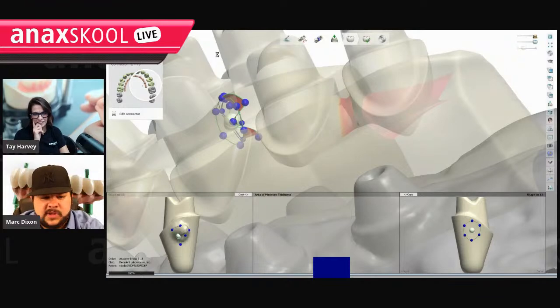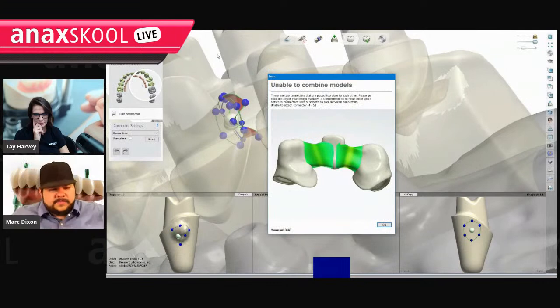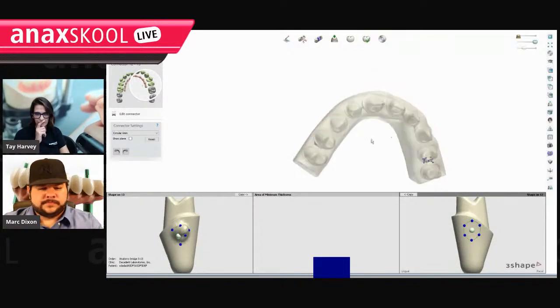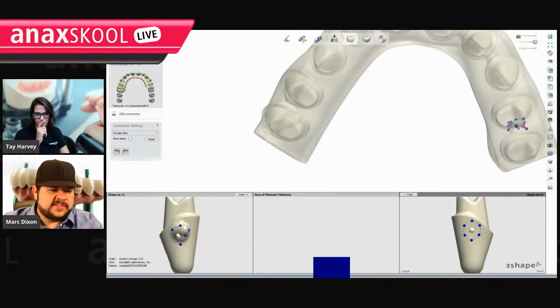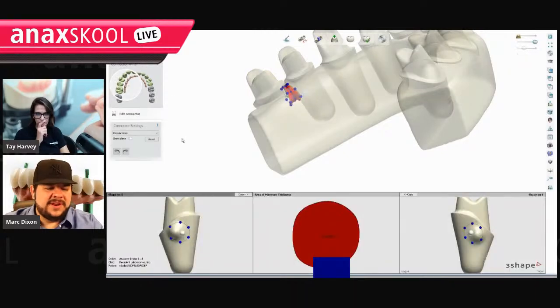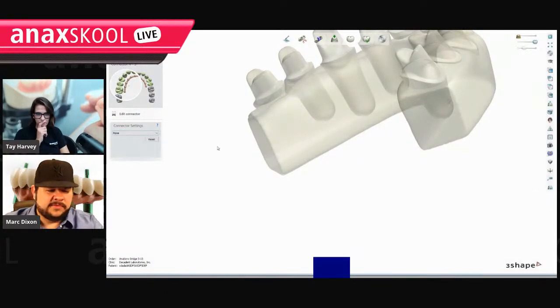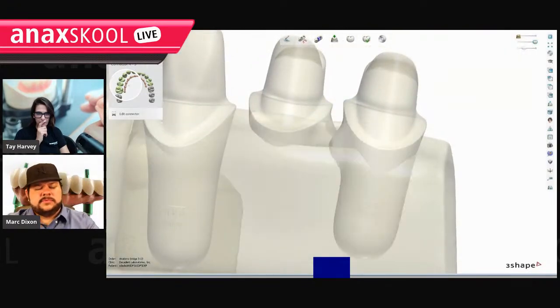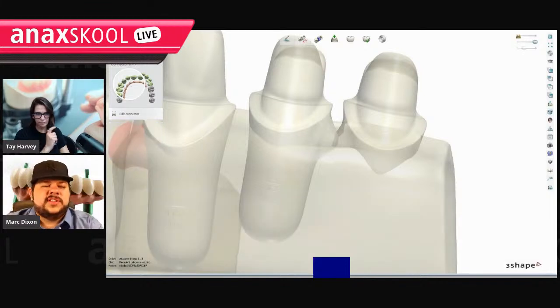Let's see. Oh, man, I logged in to help somebody one day, and what is it, 4 or 5 again? So unable to attach the connector on 4 and 5. Let's actually take a look at it. Get rid of this. This is 3, this is 4, and it wants to connect to 5. We're going to get rid of our connector. Yeah, we didn't even get rid of it. That probably would have helped. And they're touching because they're holding hands there. Aww. Silly. Well, there's just like the, I don't know.